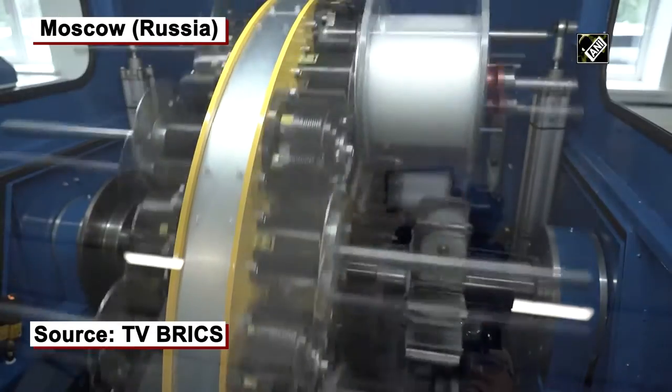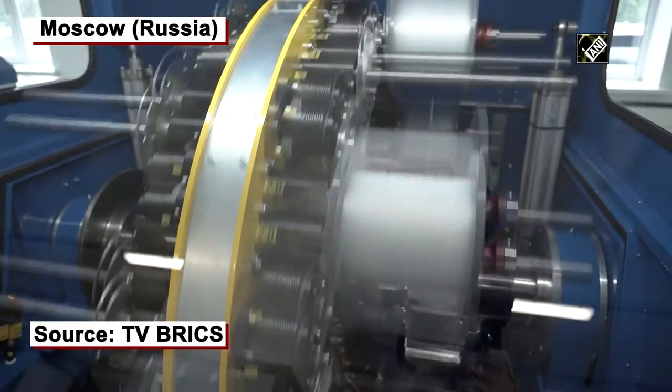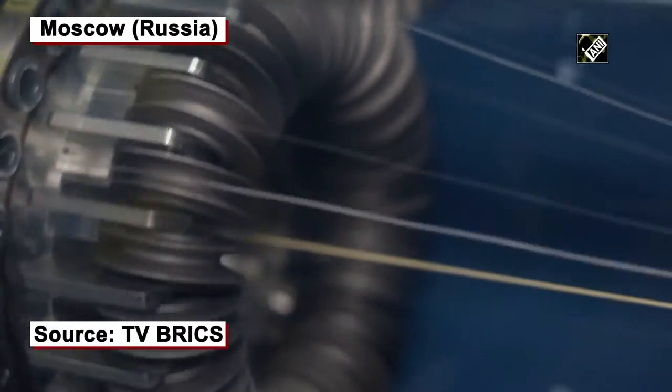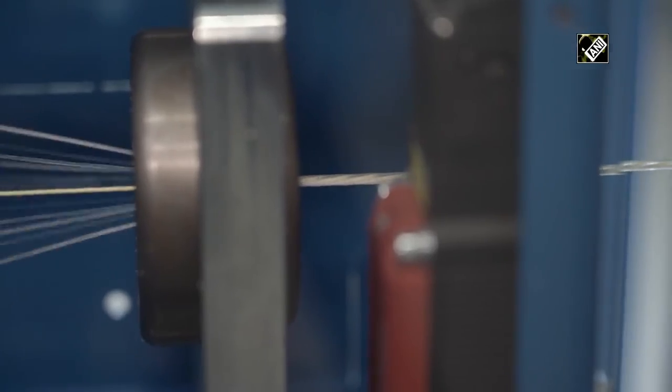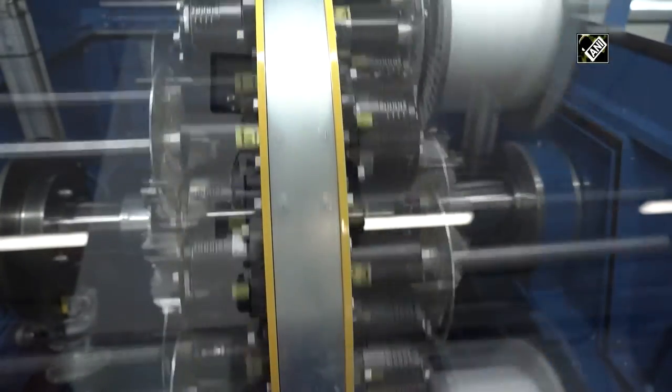A cable for an artificial heart has been created in Moscow. Engineers have spent six months to develop and implement the project. The cable has already been tested for compatibility with human tissues, which came out as successful.